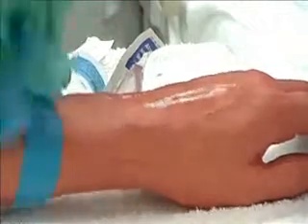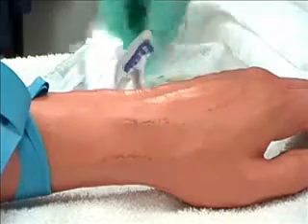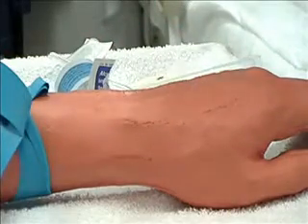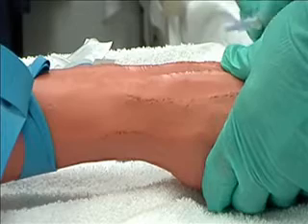Reapply tourniquet four to five inches above anticipated insertion site and check presence of distal pulse. Perform venipuncture: anchor vein by placing thumb over vein and gently tighten the skin distal to the site one and a half to two inches. Warn client of a sharp quick stick.